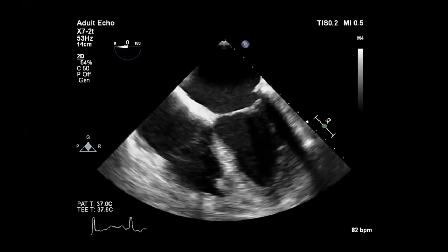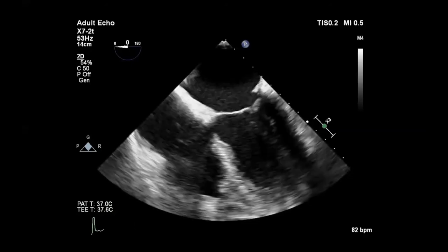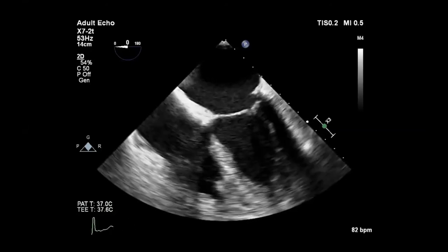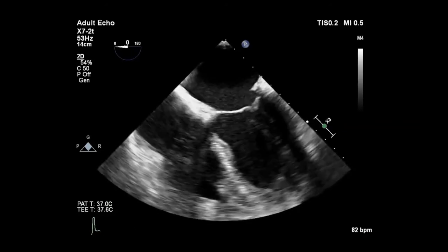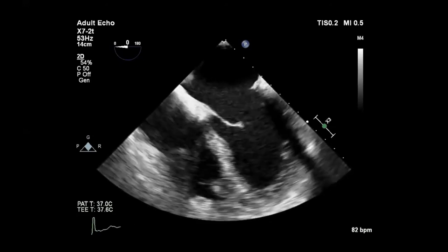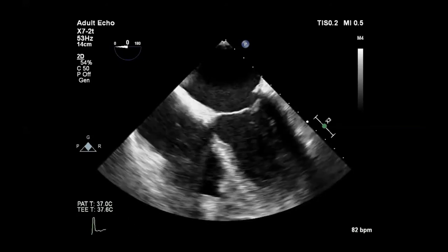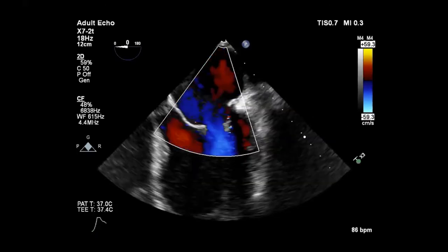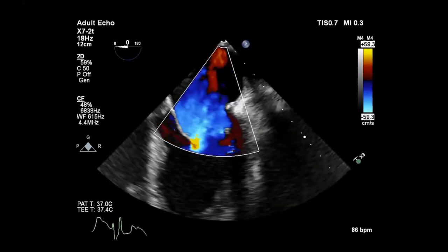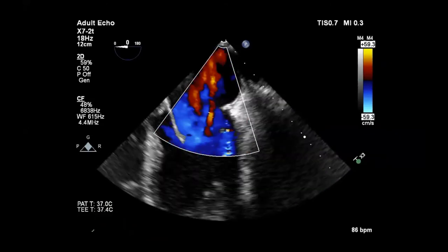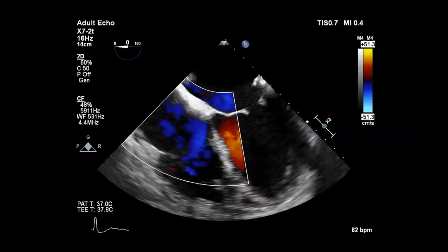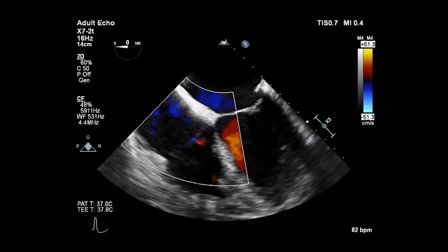This is a four-chamber view. The RV function looks normal. The LV doesn't look quite normal — it's mildly reduced — but the valve leaflets themselves don't look thickened or calcified and seem to be meeting in the middle. With color on the mitral valve, you can see a clear failure of coaptation and there's a large central jet hitting the base of the atrium. There's also trivial TR on the tricuspid.